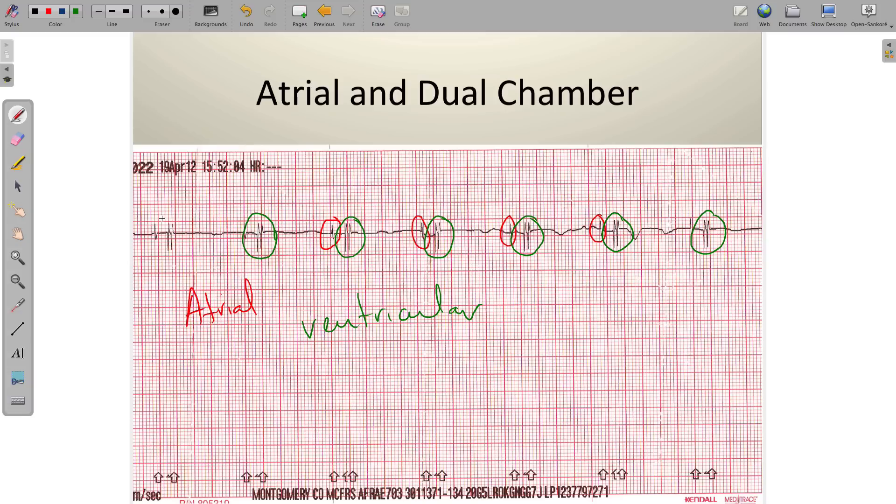When we see atrial followed by two ventricular spikes, or if there just happen to be two ventricular spikes, we're going to call those a dual chamber pacemaker. Sometimes this is a little hard to see when there's a native rhythm underneath, so this postmortem example is a neat way to see this information without any rhythm competing for space.